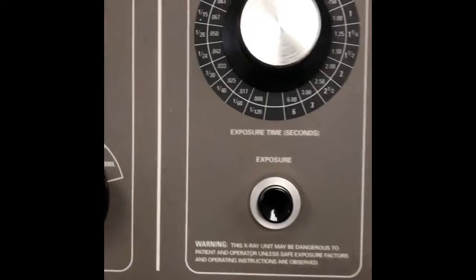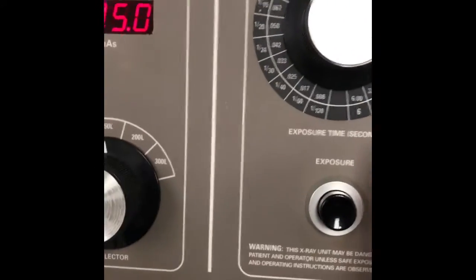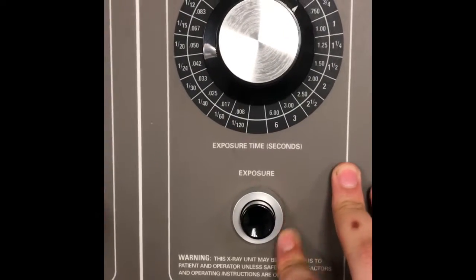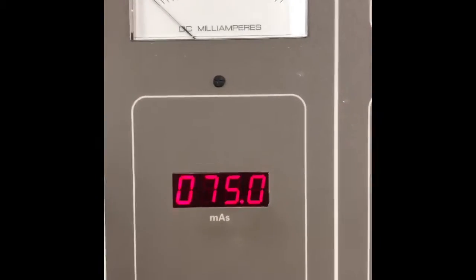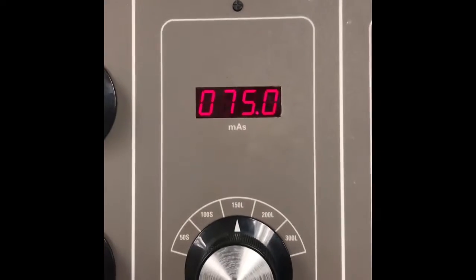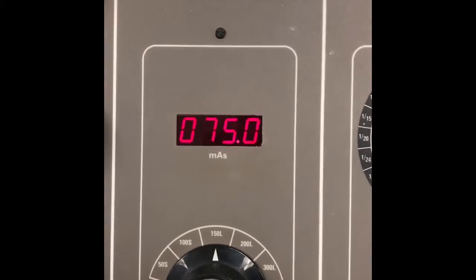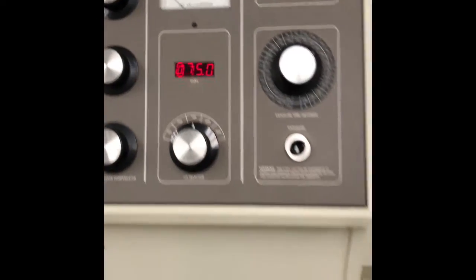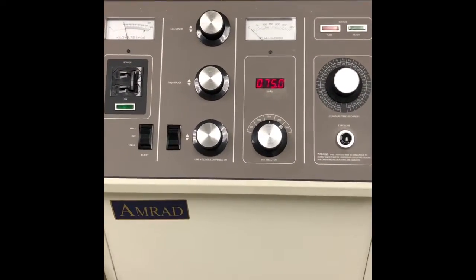And here you have the exposure switch. This literally just initiates the exposure and does nothing else. So you have your mAs, which is your milliamperage and your seconds combined. And that is the operating console and everything that you can see from the X-ray circuit.